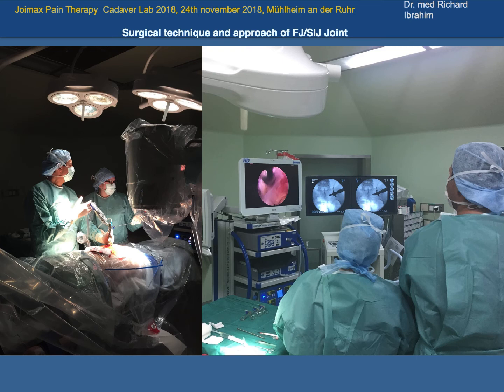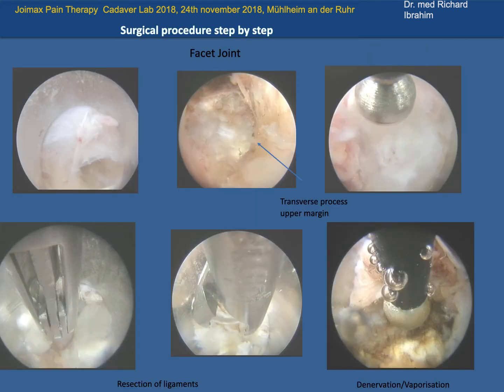So important is, if you're working on one side, it must be a clear, flexible wrist in your hand. Otherwise, you can't do more than 2 cases in one day. That's why you should know it's under X-ray control. And after I made the right approach position, I don't need the X-ray anymore. And then I look directly in the endoscopic way under visualization.